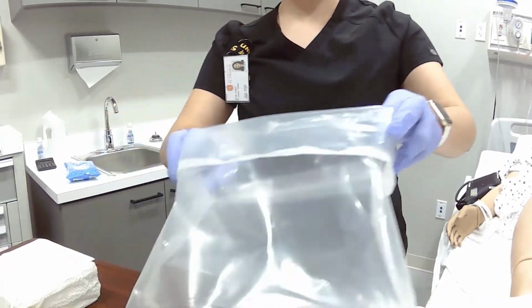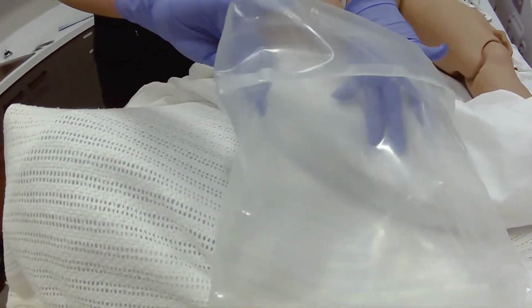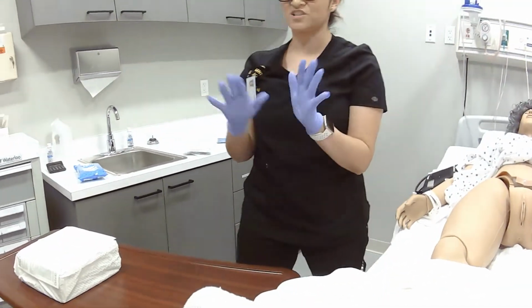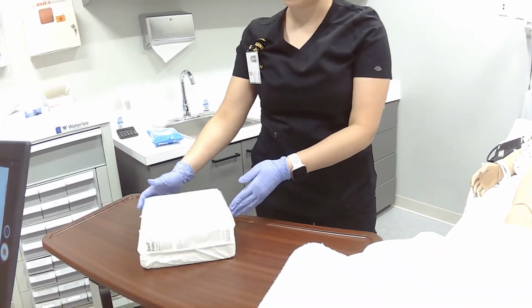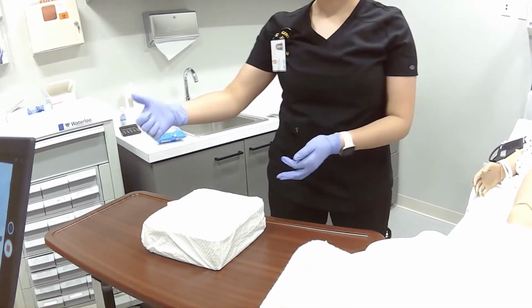And this you can put at the foot of the bed, so that way you're not reaching over. Once I'm sterile, I can't put my hands below my waist or touch anything that is not sterile. Alright, doing okay, Miss Adams? Yes. Okay, still doing good. Alright, so this we'll throw away.